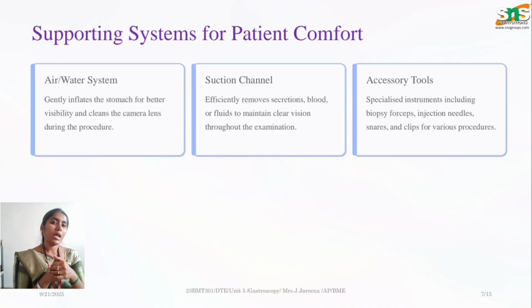And then we have other accessory tools, which are called specialized instruments, like biopsy forceps and injection needles, which are used to take a biopsy, or you can give treatments, or to have a grip to see all angles of your area. That's why these accessory tools will be used or utilized.